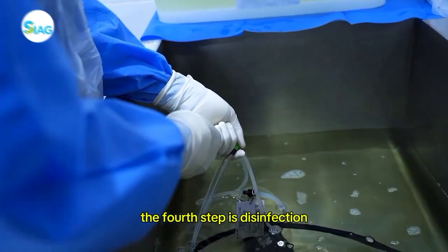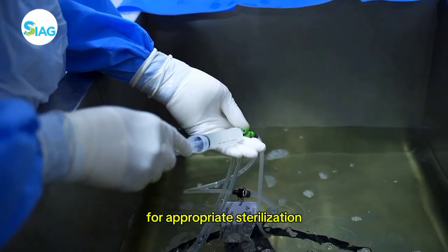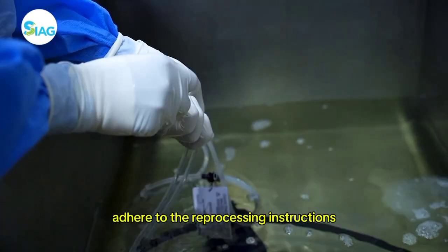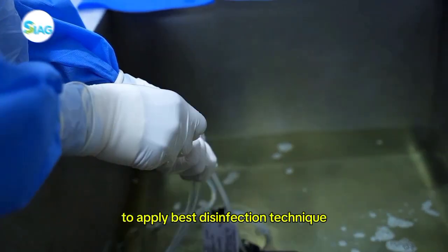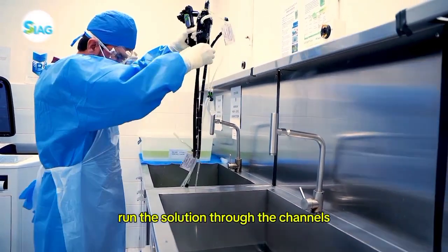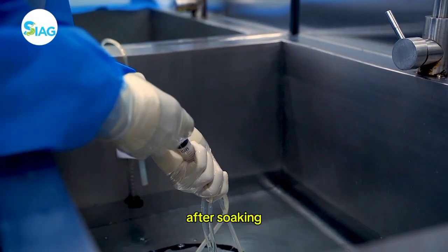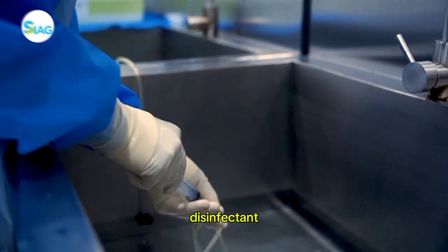The fourth step is disinfection. As directed by the manufacturer for appropriate sterilization or high-level disinfection, adhere to the reprocessing instructions. Chemicals and equipment must be examined carefully to apply the best disinfection technique. After the scope is submerged in the solution, run the solution through the channels and let it soak for the prescribed amount of time. After soaking, use forced air to get rid of any remaining disinfectant.